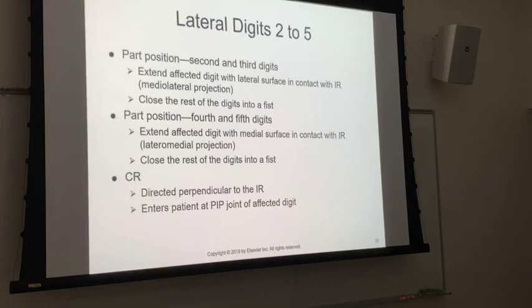No. Okay, so in an x-ray, what we're looking at is a shadow of the bones, right? And just so that you can see over there, we're looking at the shadow of the bones. So we see a 2-dimensional perspective. We can see length and width, but we can't see depth unless we get 2 views 90 degrees from each other. Now we can say, well, it's a line, but depending on which way it's going, the distal fragment may be anterior, it may be posterior, it may be going side to side, which they call varus and valgus. So we've got to get 2 views.